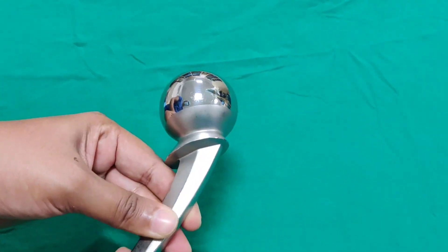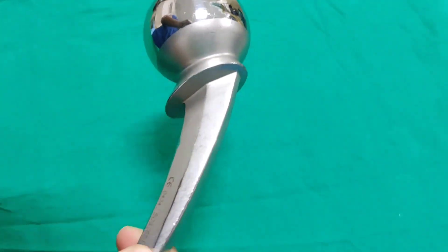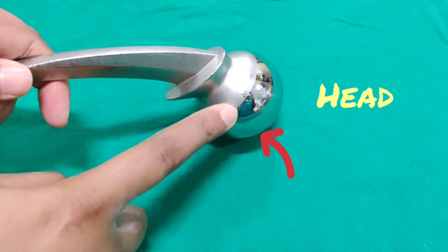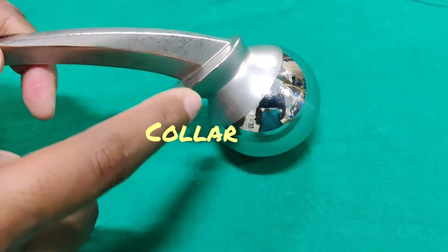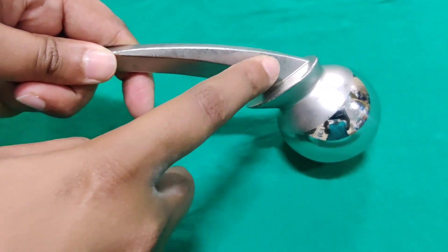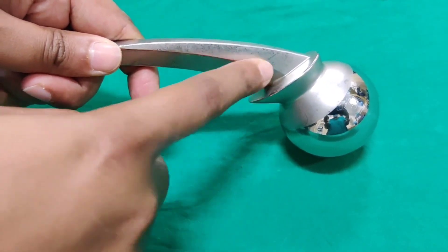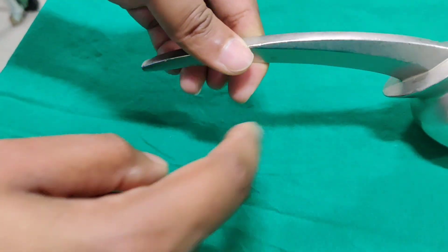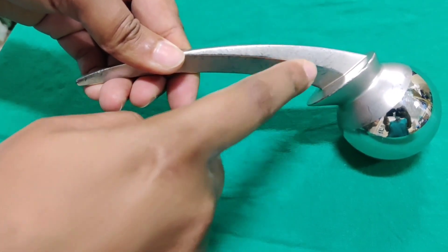This is a Thomson prosthesis. It is a unipolar prosthesis. The parts of the Thomson prosthesis are head, neck, collar, and stem. The stem of this prosthesis does not have any holes. Unlike the Austin Moore prosthesis, where the presence of holes allows bone ingrowth, in the Thomson prosthesis the implant is fixed into the bone by bone cement.